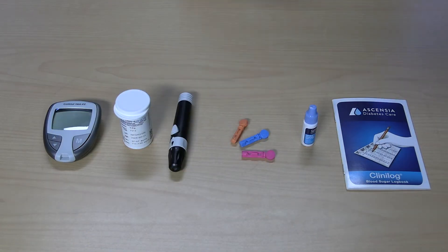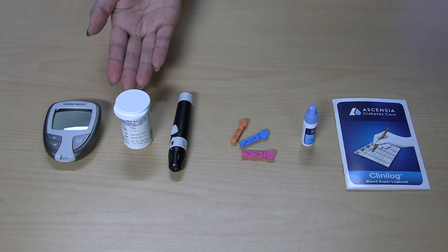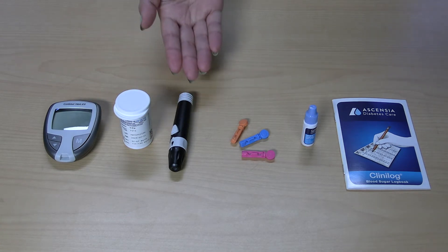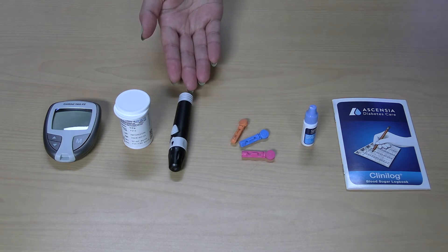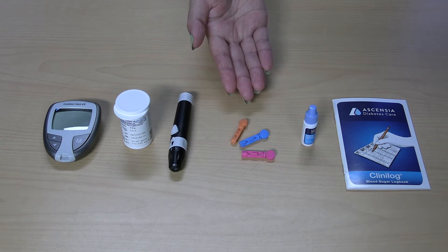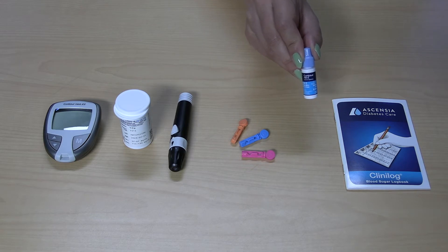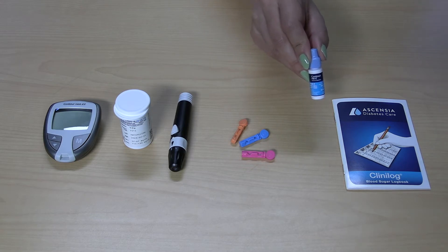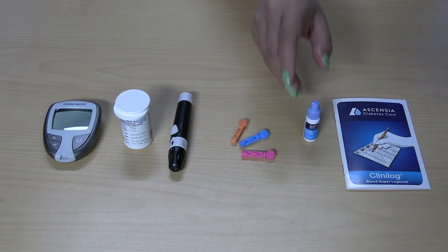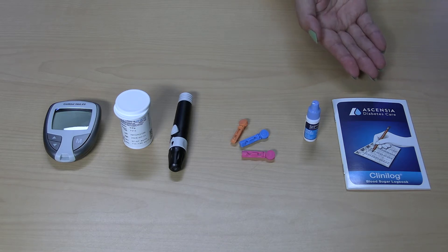First, let's review the tools and supplies you will need. Here is a glucose monitor. These are test strips which go in the meter. This is a lancet device to poke your finger. These are the lancets to load into the lancing device. This is a quality control solution to calibrate the glucose monitor and test any new strips you get. Finally, this is a logbook to keep track of the blood glucose results and show them to your physician or other healthcare professional during your next visit.